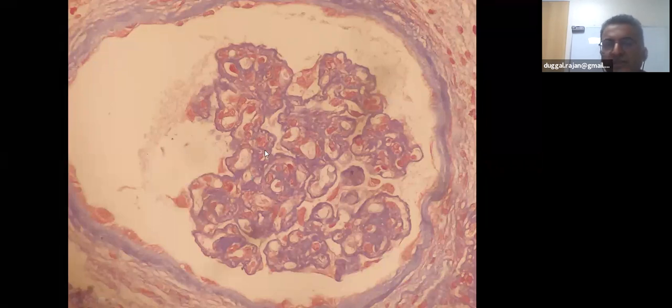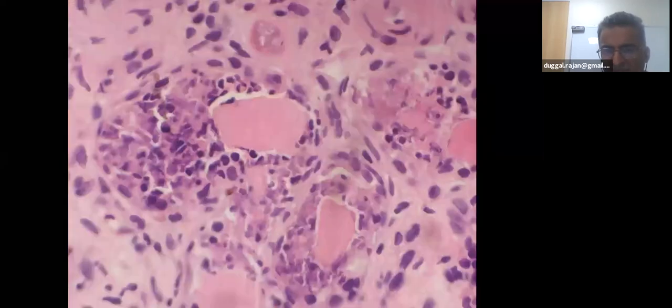So this also suggests that an ischemic insult is playing a role in causing the pathology here. Yes, in addition to all that, there was an occasional tubule showing a granulocytic cast. If I see an occasional tubule with a granulocytic cast, I don't label that as acute pyelonephritis. Many times we see cases, and these diabetic patients are prone to urinary infections, and they can get them. The only thing is, if I find a significant number of tubules with granulocytic casts, I label that as an active pyelonephritis component which could be going on.